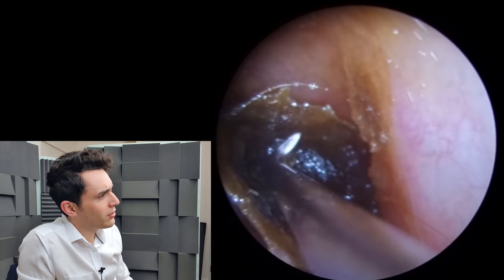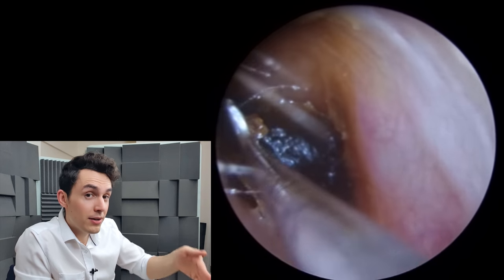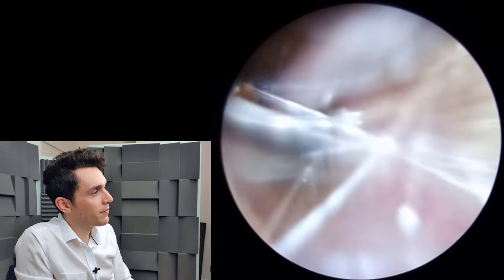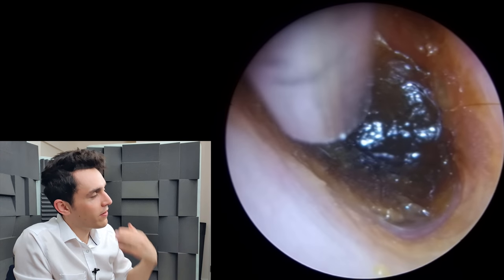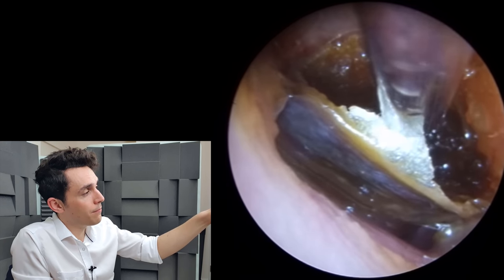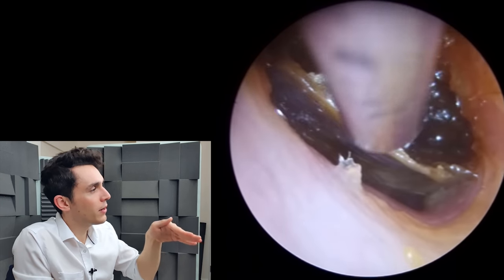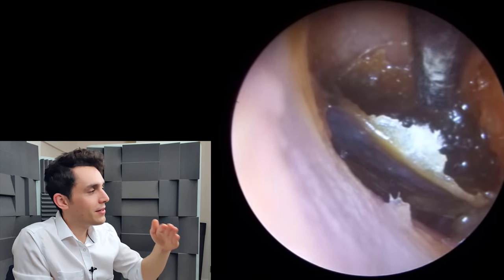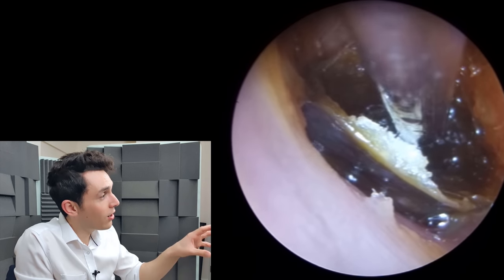I'm really just looking to move it around — that little movement where I'm lifting it is key, because that's now going to allow me to lift up a surface of this plug. These types of extractions where stuff is on the drum or you've got a plug very deep in the ear aren't usually this difficult. Watch this lip of the plug that I'm lifting up — look how rigid it is. It's not flexing. It's as rigid as plastic or cardboard. Dead skin and wax should not be that hard.